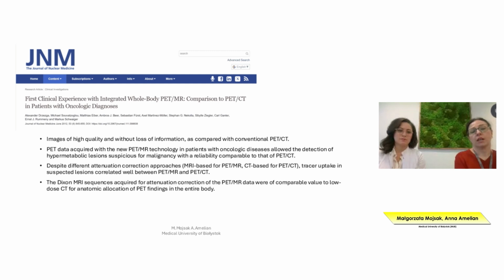So the attenuation correction approach technology, and we can speak here of some difficulties, which is the measurements of SUV and TLG, whether they are comparable with PET-CT technology, whether these are compatible and comparable values, and whether the activity of tumor changes can be compared between various techniques applied.